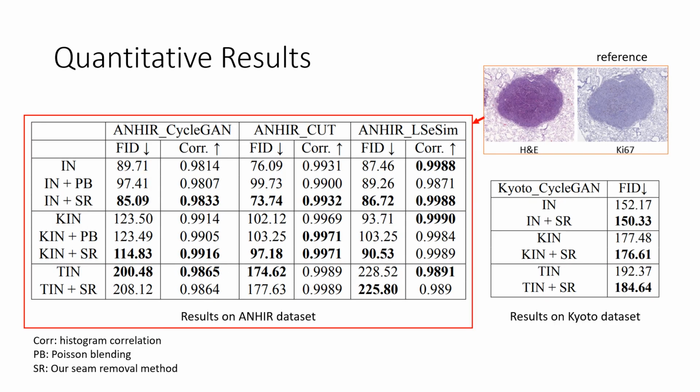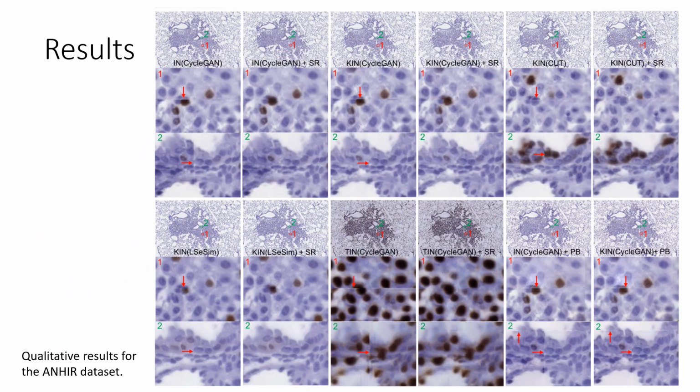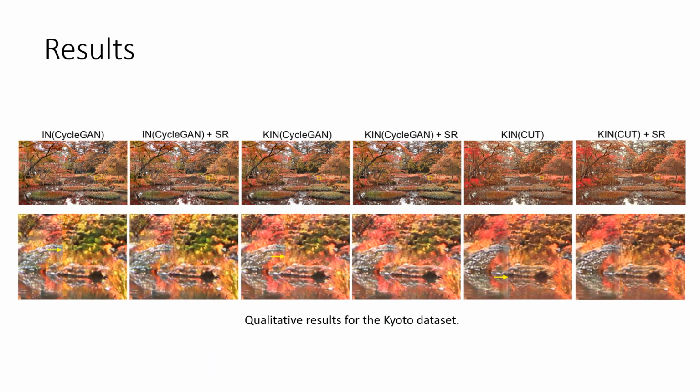Measured by commonly used FID and CORR scores, our method improved existing IN and KIN-based results by large margins. For TIN-based results, due to their inferior initial quality, our method did not improve them much. Our method also improved upon IN-based results on the Kyoto dataset significantly. For qualitative results, through close visual inspections, we see that the visible seams are consistently and satisfactorily removed by our method in the medical image dataset. Tested on the Kyoto Real Photos dataset, we also see satisfactory seam removal performance by our method.